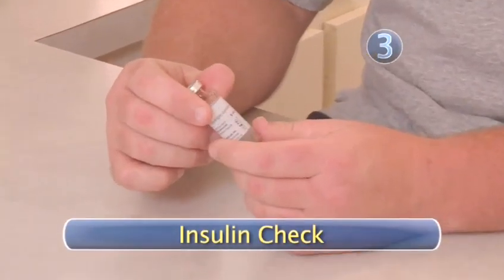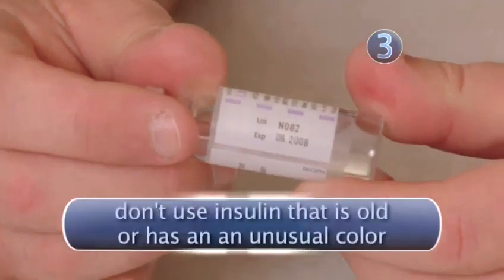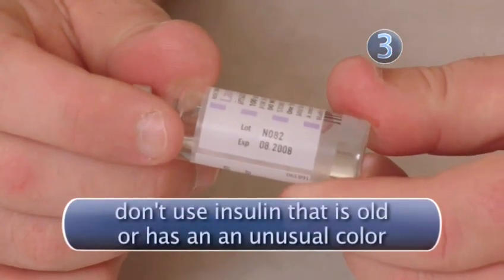Step 3: Insulin Check. Check your insulin to see how much you need to administer, the insulin type, expiration date, and the color.